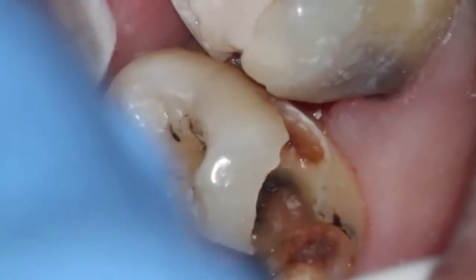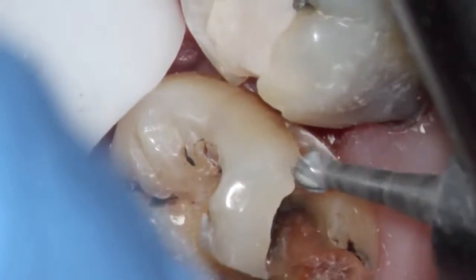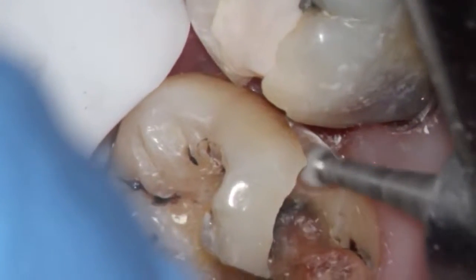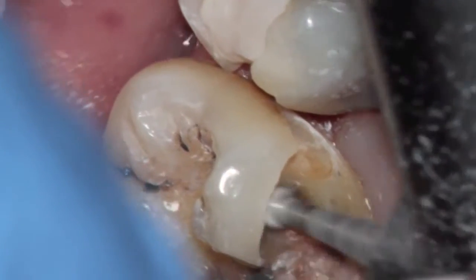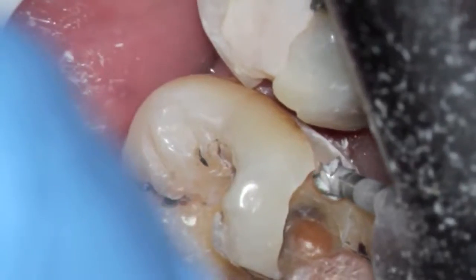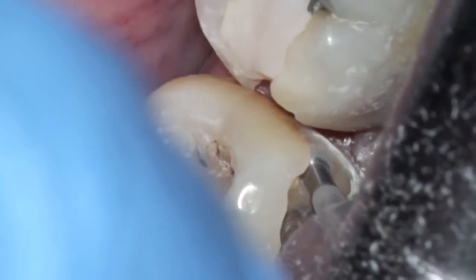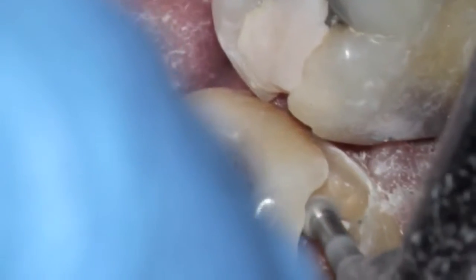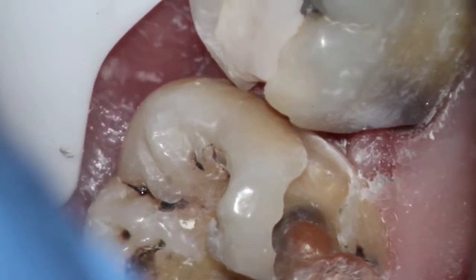And one of the questions would be, why don't we just go ahead and pull this tooth? Patient really doesn't have very many teeth on the other side. This is her chewing side. She couldn't afford an implant, and she's willing to take the risk of possibly needing a root canal on this tooth someday in the future, which no doubt will happen with a tooth that has this large of a filling. And she will also realize that the tooth may chip or break and need a crown at that time. But for the present moment, her finances just allowed her to remove the decay, and if necessary, she would go ahead and do the root canal, but she would prefer having a large filling done.